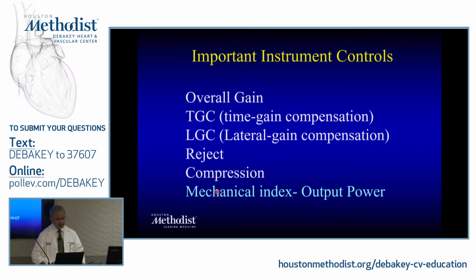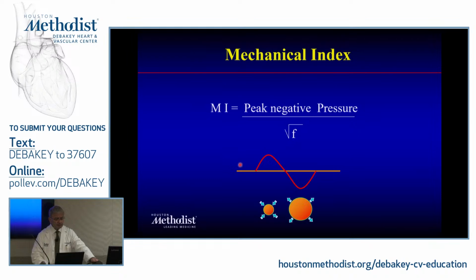Mechanical index, as opposed to all the others, mechanical index is actually the output power. All the others are reflected. So this is not the energy that you're sending. This is how you're processing the signal, enhancing it, decreasing it. You're not doing anything to increase the energy or destroy whatever other things that you're doing, okay? So the mechanical index is actually the output power. Mechanical index is peak negative pressure divided by square root of the frequency itself.